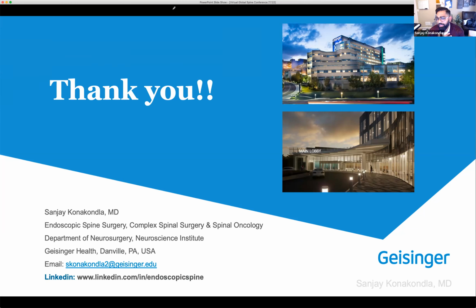I personally think everyone's individualized from a surgeon perspective, but the number you're hearing a lot, obviously, at these conferences is somewhere around 50 to 75 lumbar cases before you progress to thoracic endoscopic cases. But as we know, and we're all in academic institutions as well, everyone learns differently, everyone applies themselves differently, and everyone has their own interests, right? So I think doing a little bit more and more each case is going to be the key there.